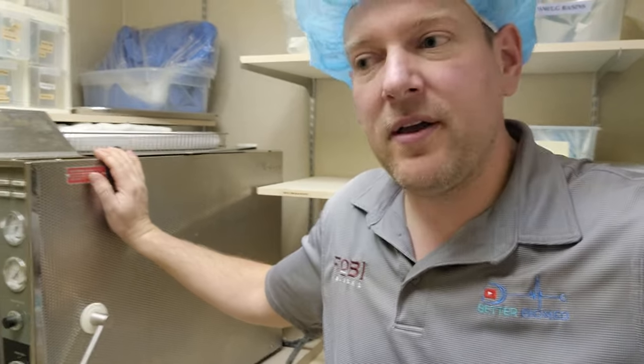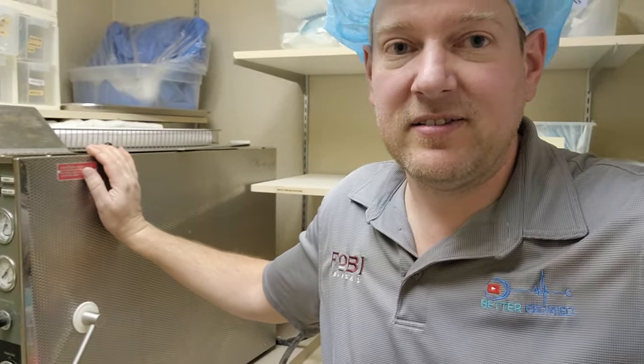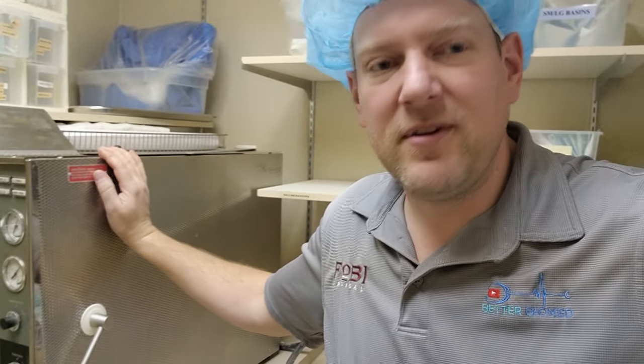This is one of those last minute calls, and I was not expecting to walk in on a bunch of charcoal. So guys, you never know what you're going to get, and when you have PMs, you have devices like this that could be pushed back on their own plug, make sure there's some sort of bump stop back there that will prevent that from happening, because every single time you will have a failure when a device impacts its own cord back behind it.